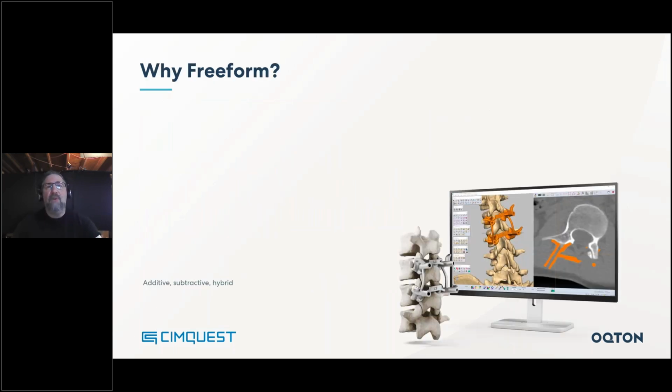So why Freeform? Obviously, there are challenges and requirements in the healthcare space, and Freeform is one of the best solutions that I've ever encountered. Efficient and effective patient-specific instrumentation design. While traditional CAD systems are great for mechanical parts and the use cases they are traditionally known for, this is not their strong point.